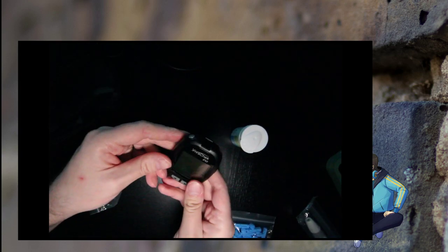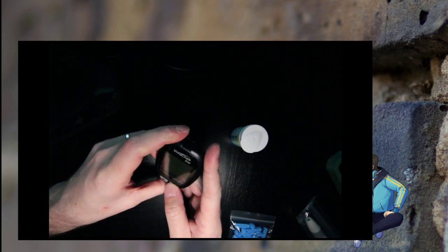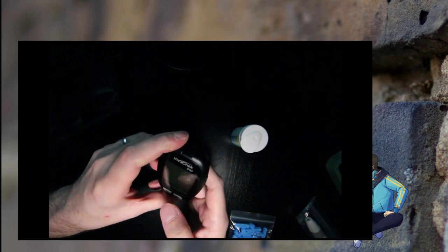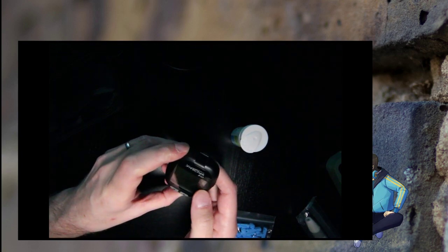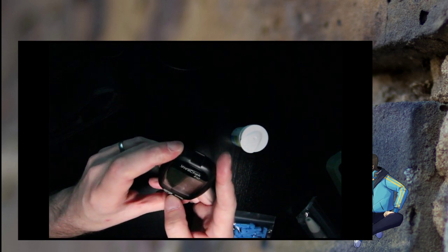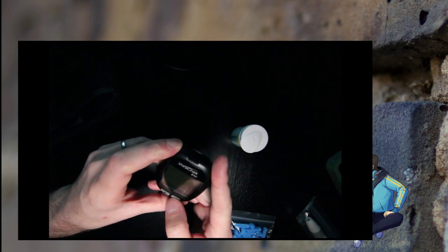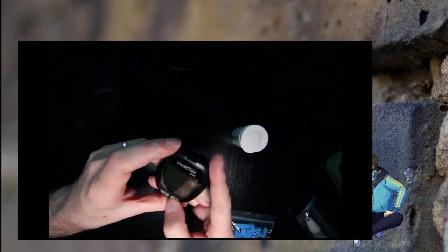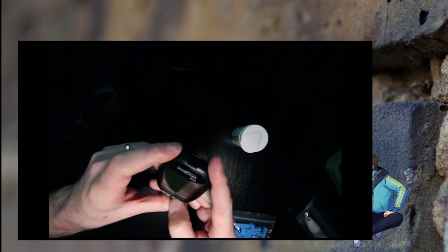Oh, it's beeping. Yeah, it's asking me what time it is, and it is close. The minutes are fine, but it's not 12, it's 19. Okay, and how do I tell it? Press this button over here. Yeah, it's not the first day month. It is 2021. It's not the third of the third. It's the seventh. Month is seven, and today is the 23rd.